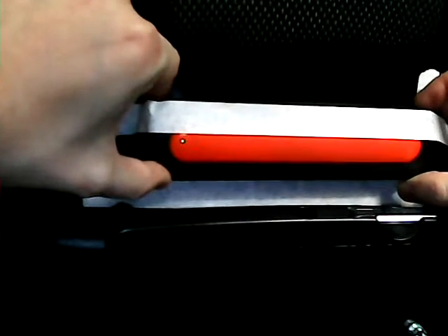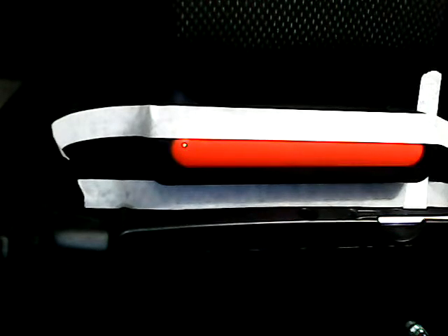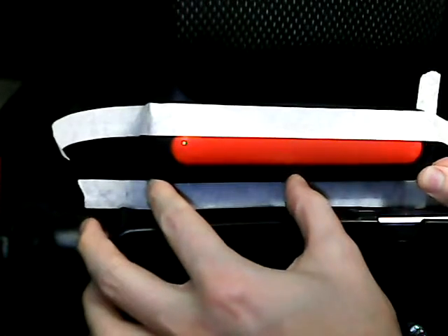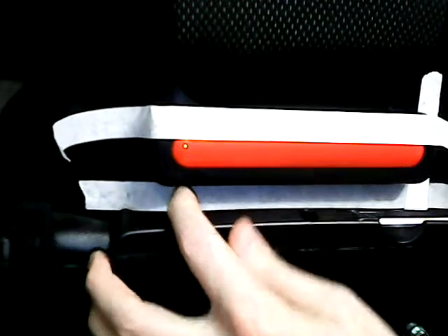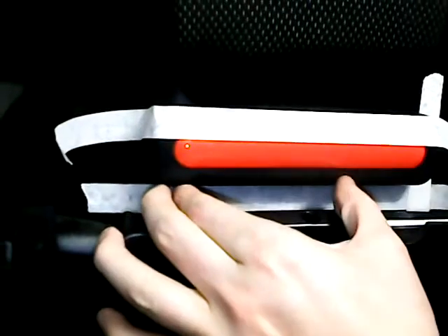Now, for temporary bracing, just so it won't move, I'm going to go ahead and put a piece of masking tape over the top. I'm going to have to make a slight adjustment again. There we go, and I'm checking for straightness again. Okay, it's there, that's fine. Now that would give just a short-term bonding and just a little bit of pressure. What I'm seeing, and it's not quite visible on the camera, is a dot of the PL 9000 right there in that corner, and that's why I'm making these fine adjustments.